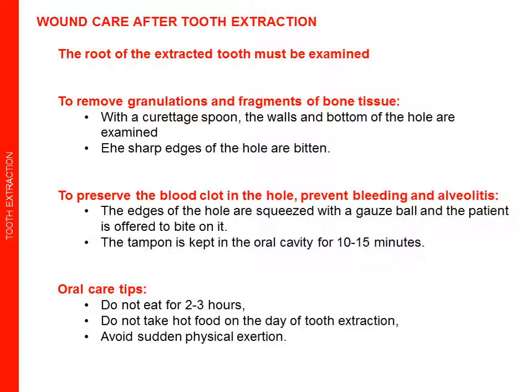To preserve the blood clot in the hole, and prevent bleeding and alveolitis, the edges of the hole are squeezed together with a gauze ball and the patient is asked to bite on it. The tampon is kept in the oral cavity for 10-15 minutes.